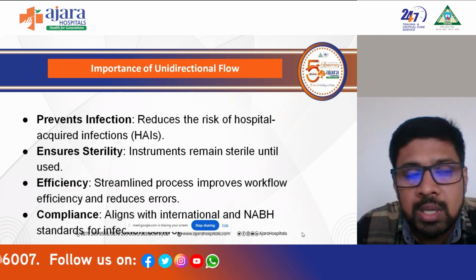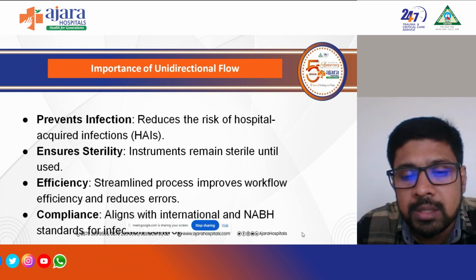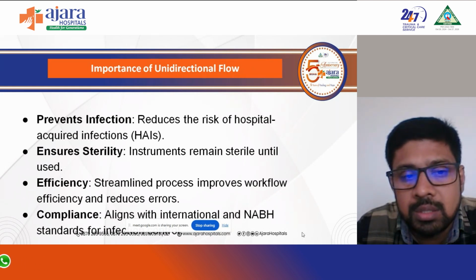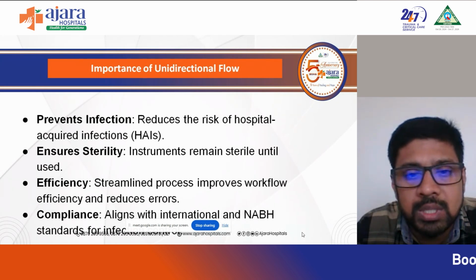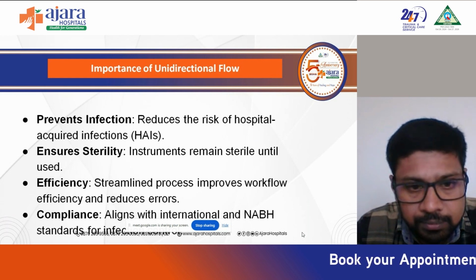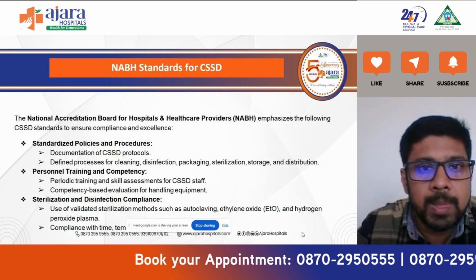Once the instrument is ready to use, if it goes back to the dirty zone, it is considered a contaminated instrument. So there is no backward flow. You need to maintain the sterility in the unidirectional flow. This is one of the importances of unidirectional flow in the CSSD. Then efficiency and compliance. These are some importances of unidirectional flow.